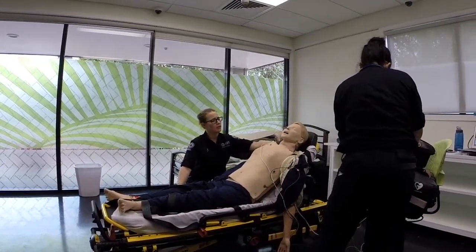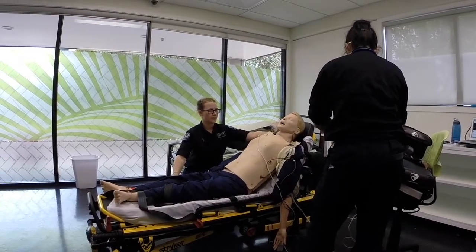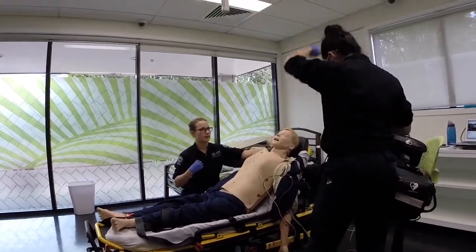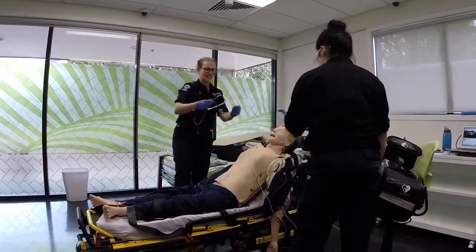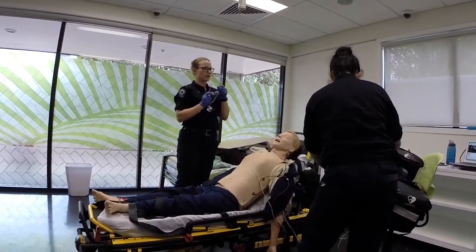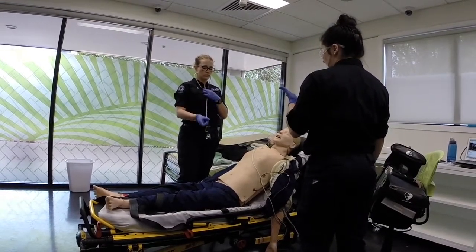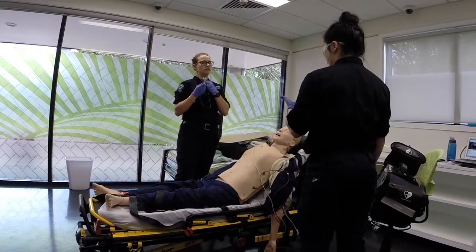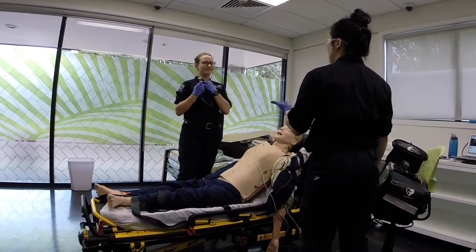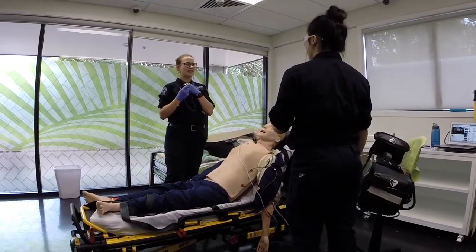So, how are those vitals going? Just printing my ECG now. Perfect. Oh, yes, thank you. So he's got a peripheral cap refill time of 4 seconds. 4 seconds? His blood pressure is 70 on 40. Yep. He's got a respiratory rate of 18. Mm-hmm. A BGL of 7.6. A temperature of 37. And a SpO2 of 88.